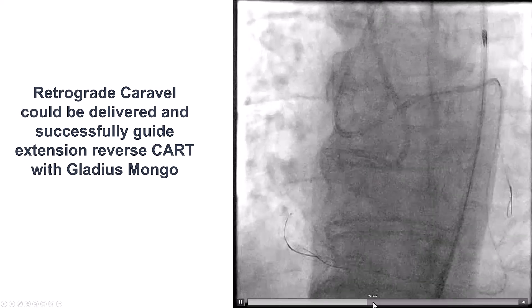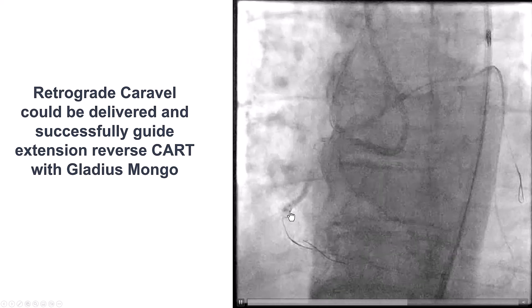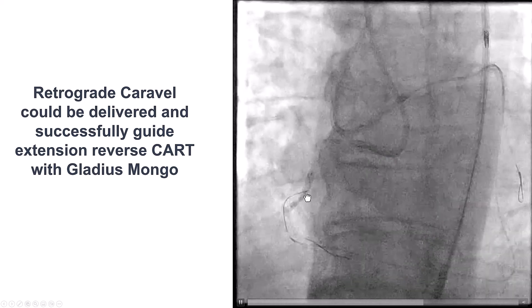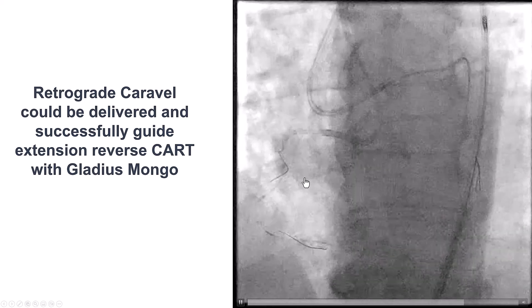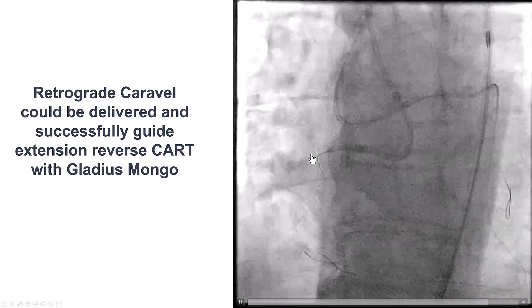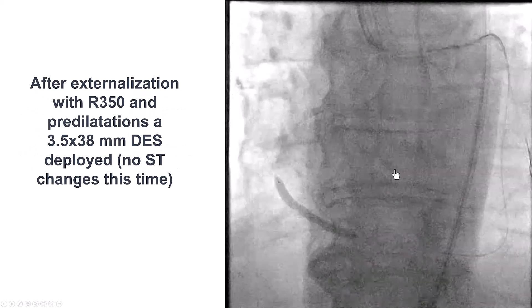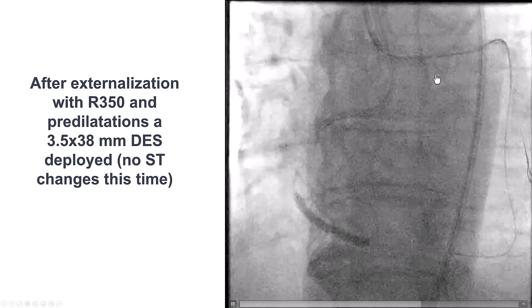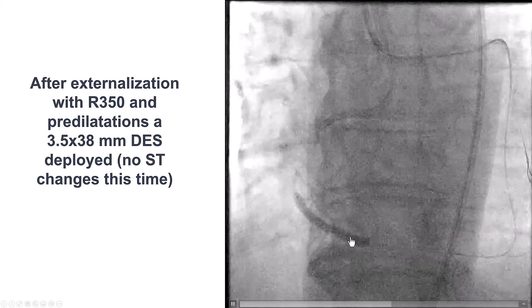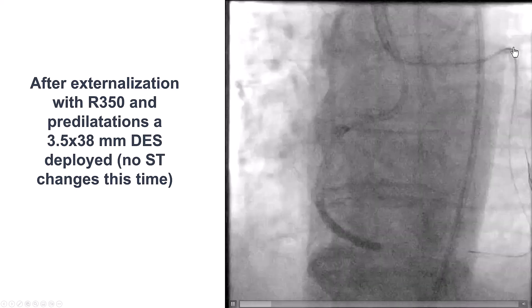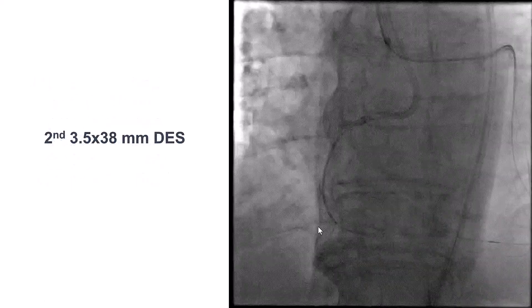We then advanced a Gladius Mongo guidewire using the reverse CART technique — the antegrade balloon inflated, and then the retrograde Gladius wire advancing along the course of the vessel. We successfully entered into the antegrade guide catheter. We were concerned about ischemia again, but fortunately the patient remained very stable despite externalizing the guidewire — perhaps due to the low profile of the Caravel microcatheter.